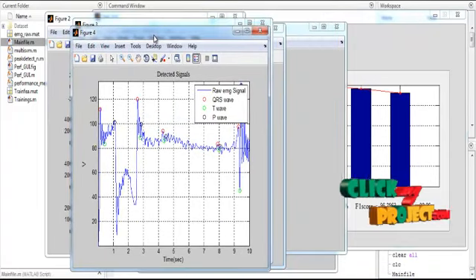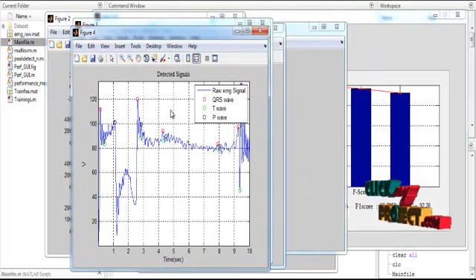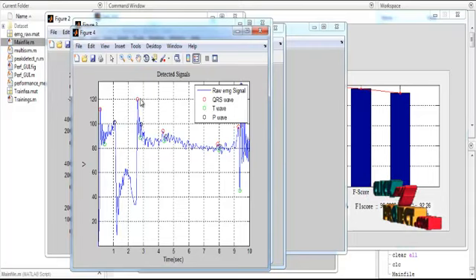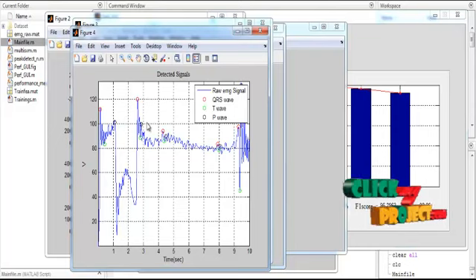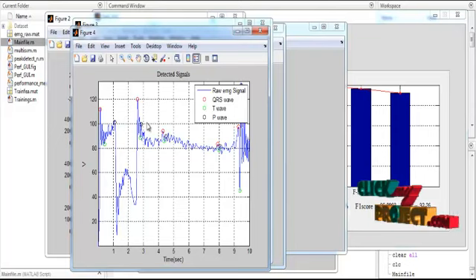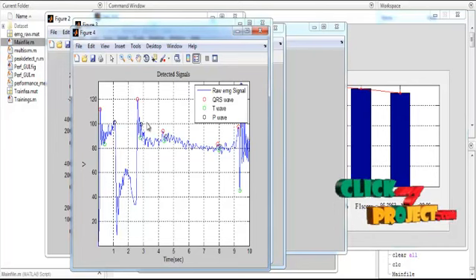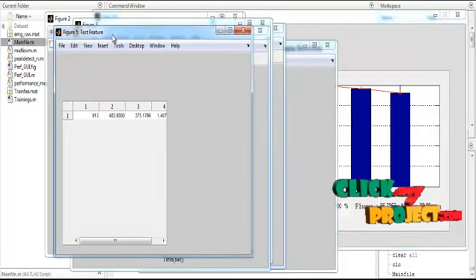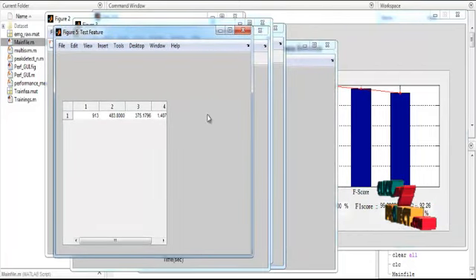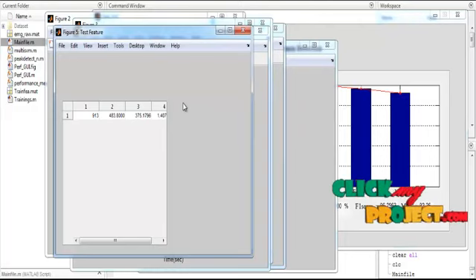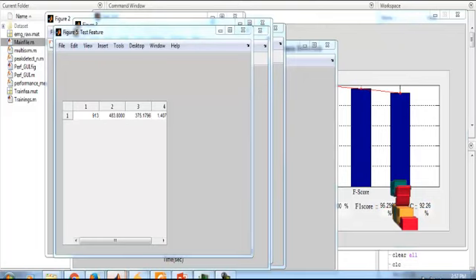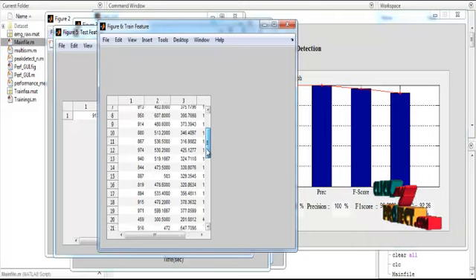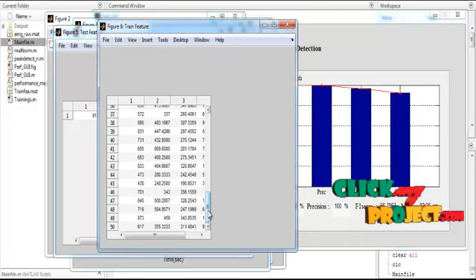After estimating these three parameters, the QRS wave is detected from the signal. The Q wave is represented in red, the T wave in green, and the P wave in black, while the raw filtered signal is plotted in blue. After QRS detection, feature extraction is performed by collecting data from the signal, and the values are plotted as test features. The training features of all dataset signals are shown in Table 6.